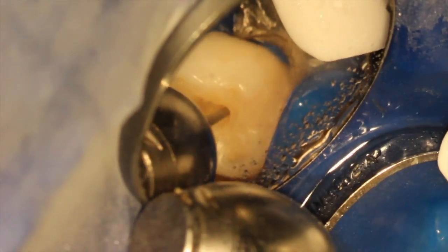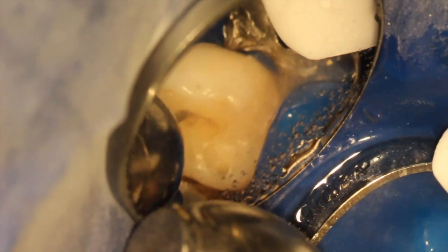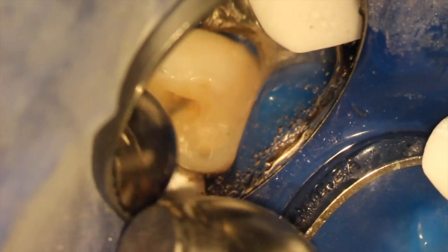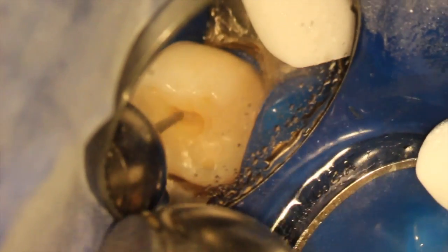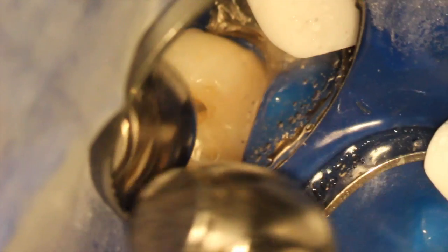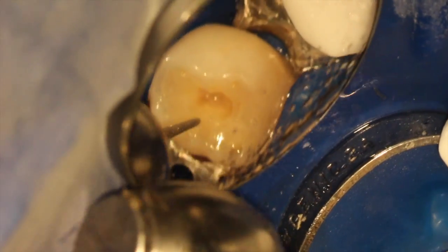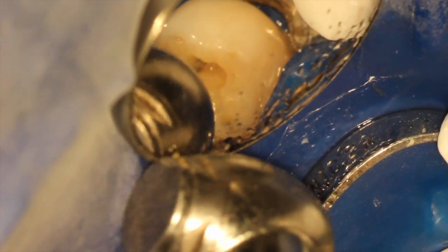This is a primary tooth — a lower molar, baby molar, tooth K. They're smaller, their anatomy is different, their roots are divergent, and the pulp chambers are a little different. But when we want to keep them and the patient wants to keep them, this is our only option.